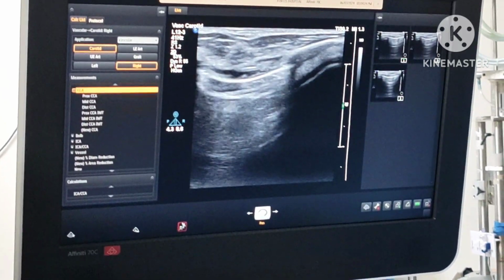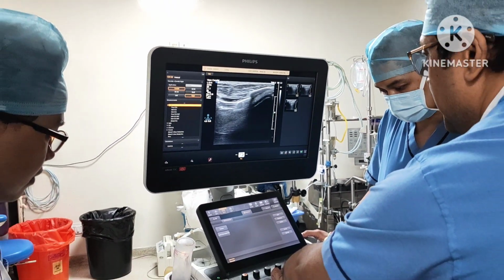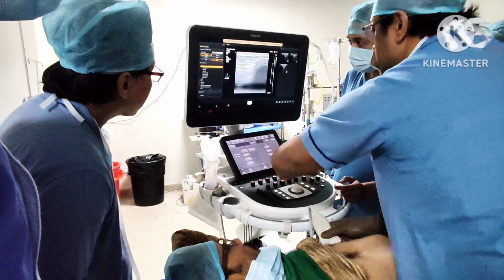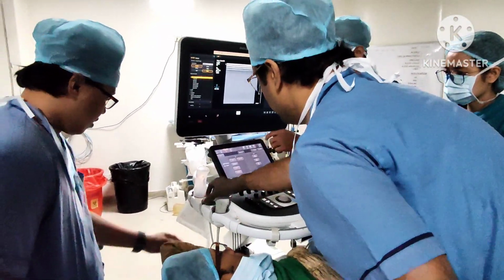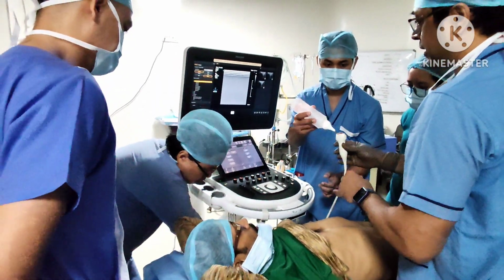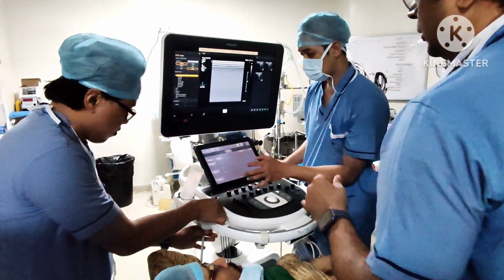Okay. So now after this, I've checked it out, I will try to use the M mode. For the M mode, I have to use a different probe. With the vascular probe, this is not going to work. For M mode, I need to use a different setting. So change the probe. This is a cardiac probe, right? 5-1. Change the probe to 5-1.